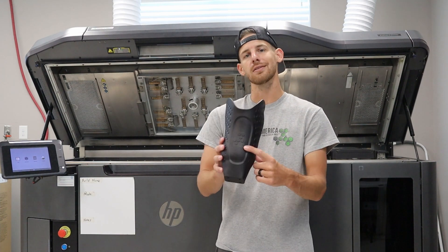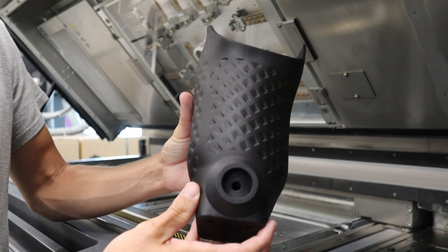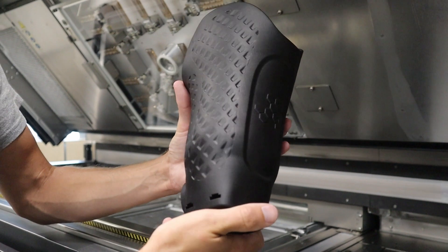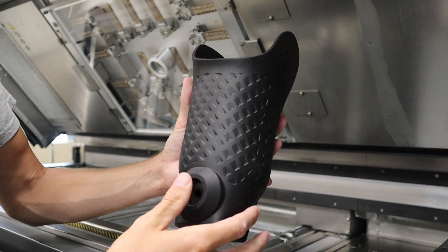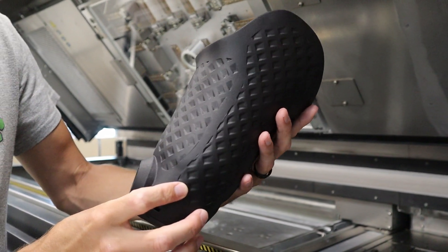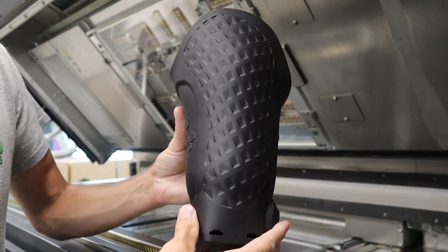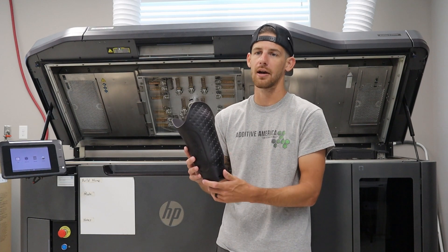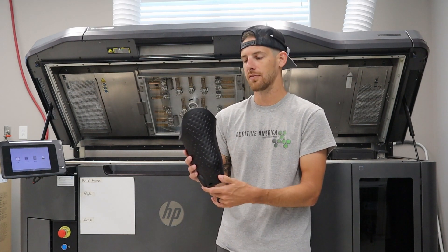We were able to add a logo in here — we added an Additive America logo, why not. The patient wanted something like a diamond plating look on the side, so that's what this pattern is that you'll see here, basically all over the socket. It just adds a little extra layer of uniqueness and a way for the patient to express themselves. The pattern can be anything — we've done paisley patterns, this type of pattern, textures, camouflage textures — very cool options.